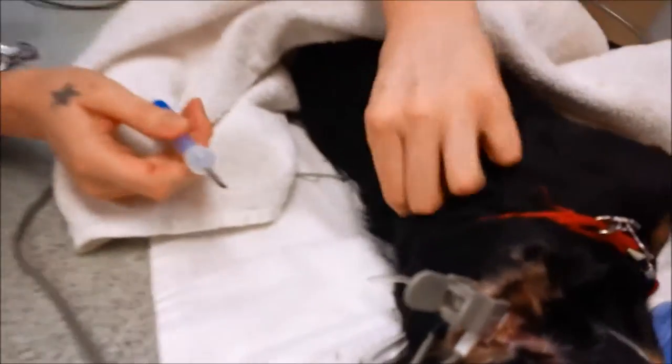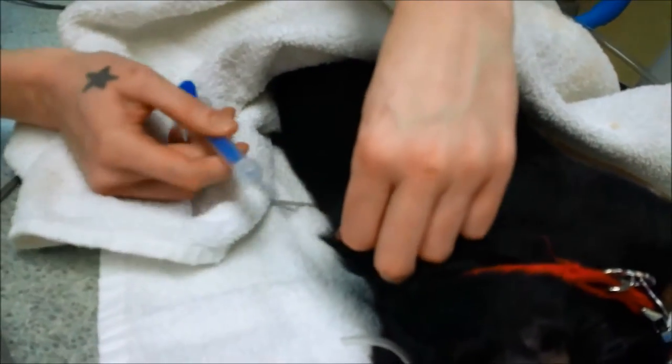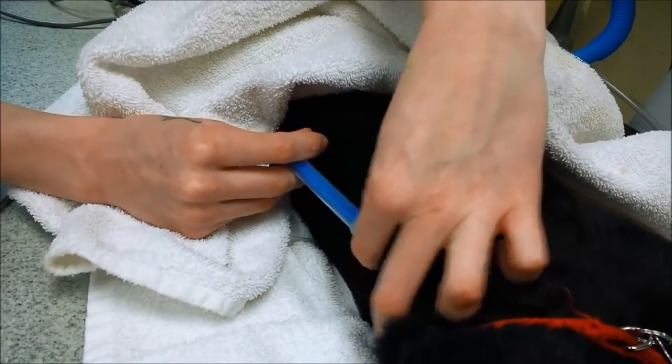I'm going to go up and try to part the fur so I can see clearly, make a little tent, insert the needle — and I'm inserting the microchip.